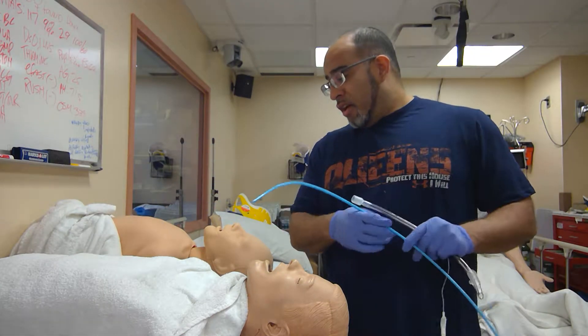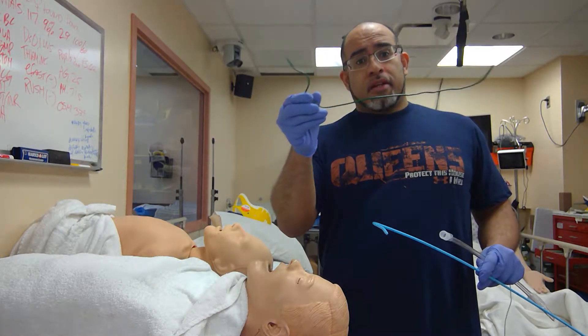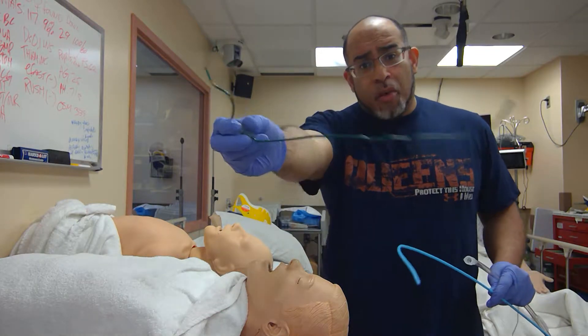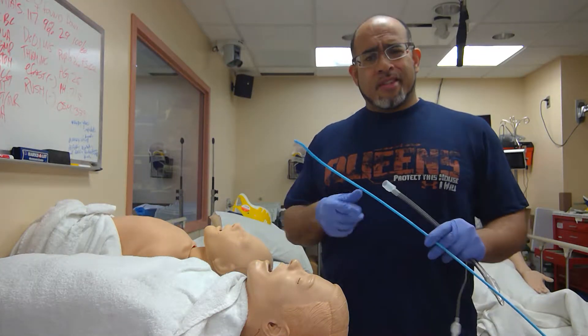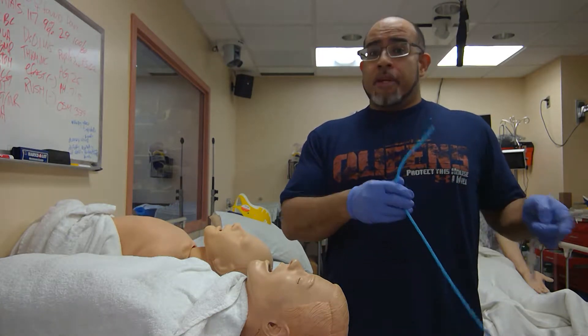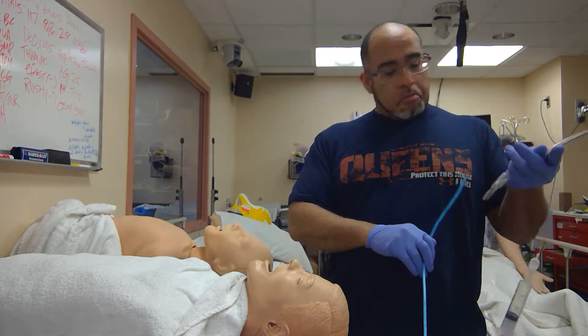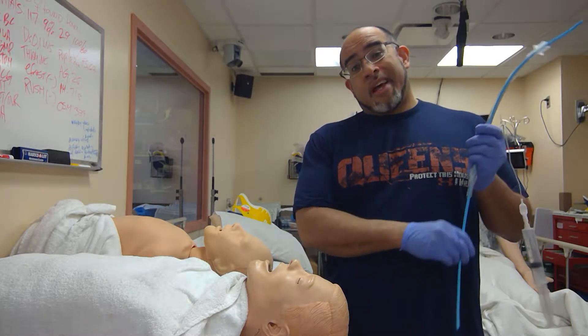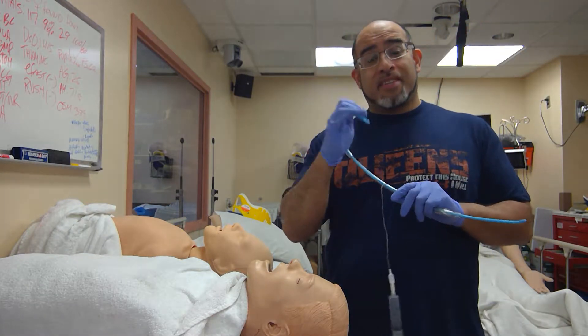People are still in love with this thing called a stylet, and they do not want to change their ways because this is what they were taught with. They don't want to improve things. The study just came out — very smart people saw a 10% increased success rate. Not bad for novice intubators. But the issue is the novice intubator has to have a backup. That backup is the attendant.